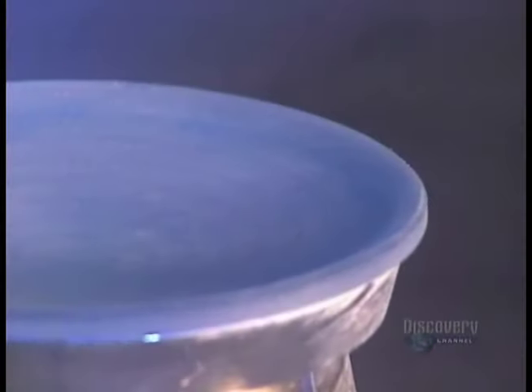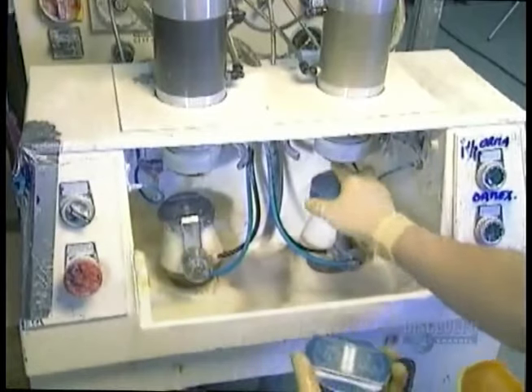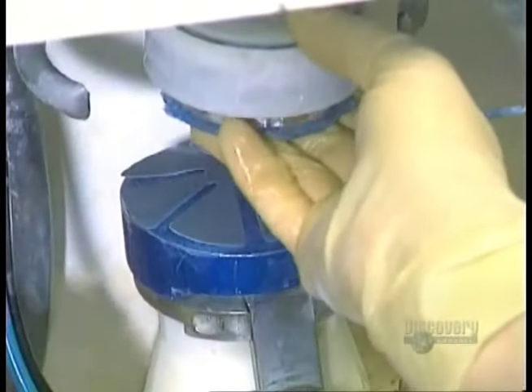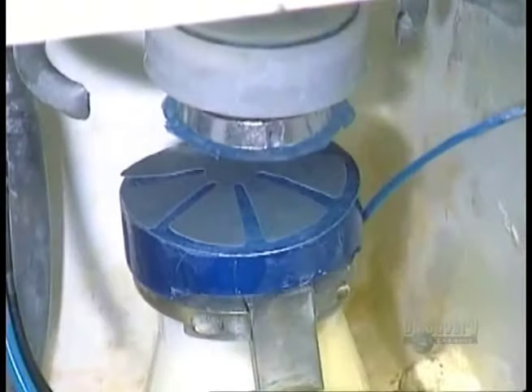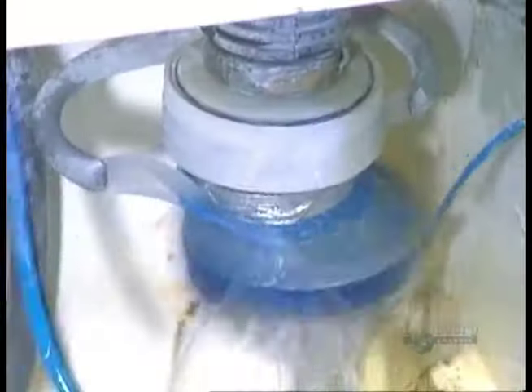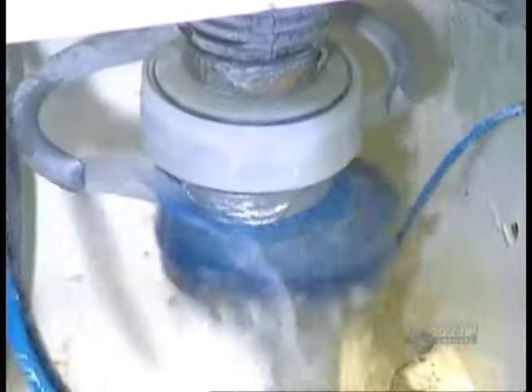But you can still see the concentric circles left by the tooling, and the surface of the lens is rough. So they polish it, using abrasive paper under water heated precisely to 19 degrees Celsius. The water temperature must be constant, or else the lens will become deformed.